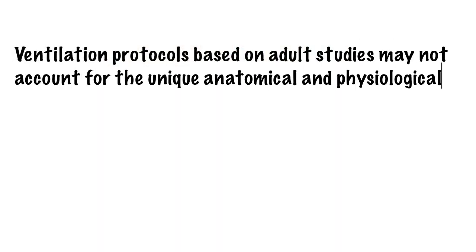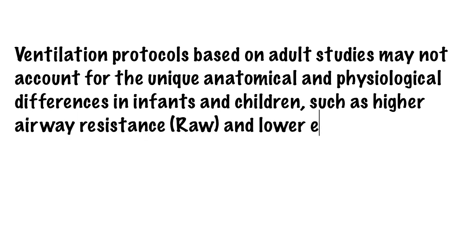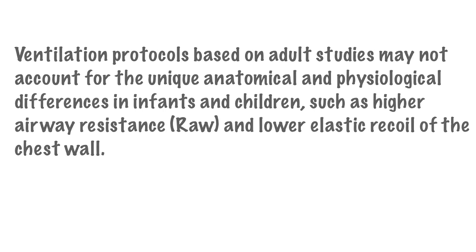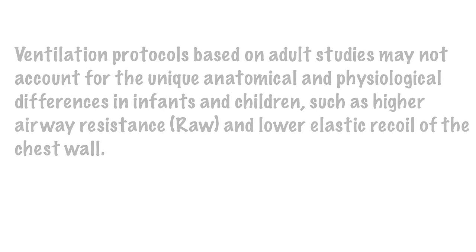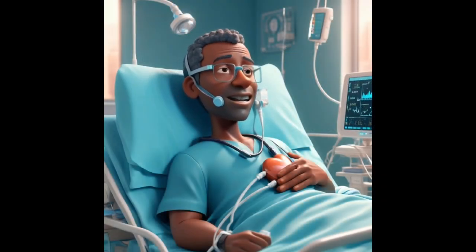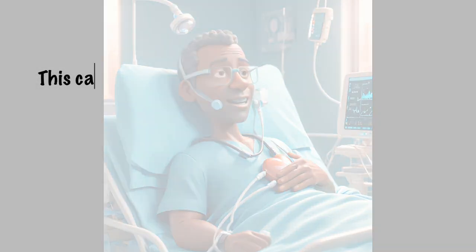Ventilation protocols based on adult studies may not account for the unique anatomical and physiological differences in infants and children, such as higher airway resistance and lower elastic recoil of the chest wall. This can lead to suboptimal ventilation settings and increased risk of lung injury.